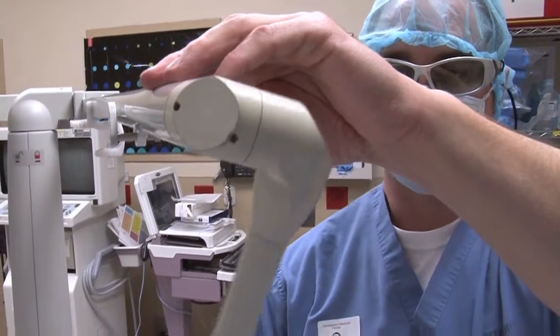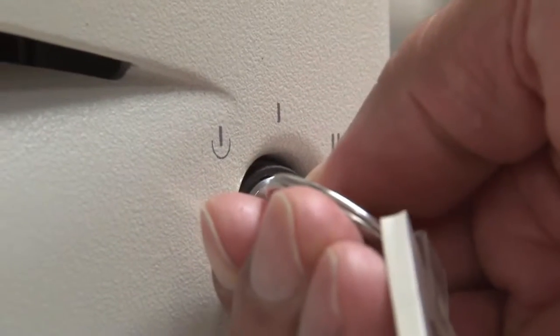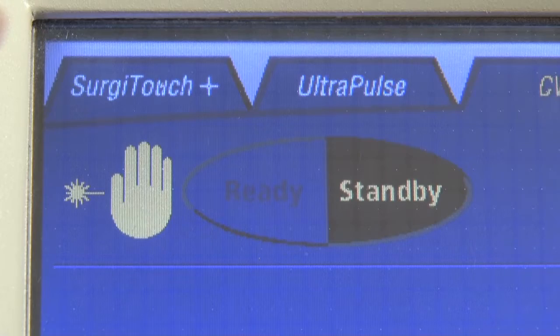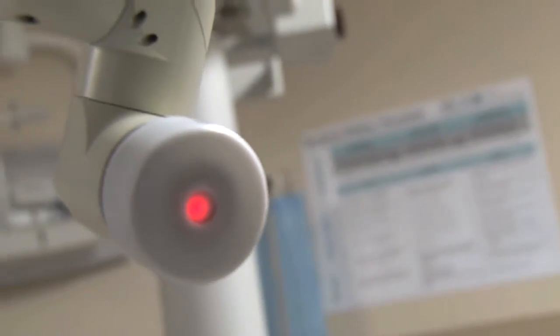If a laser utilizes an articulated arm, check that the laser's aiming beam is centered on the arm. To check this, turn on the laser. With the aiming beam on and the laser in standby mode, the technician should place a white cap or a piece of paper tape on the distal end of the articulated arm.